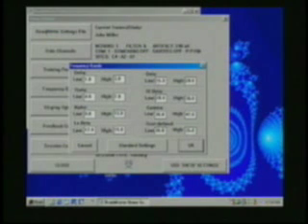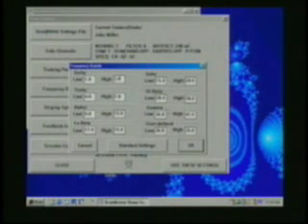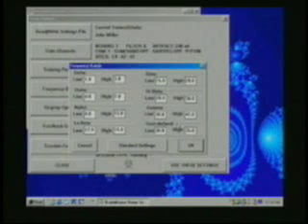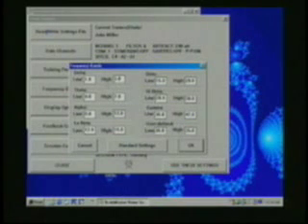low beta, beta, high beta, gamma, and a user defined band. These are the preset frequencies which are most commonly used. But these can be changed with a resolution of a half of a hertz.